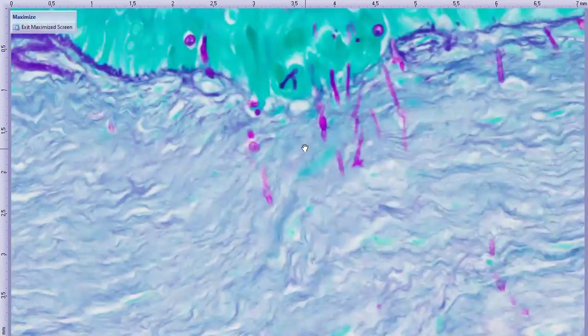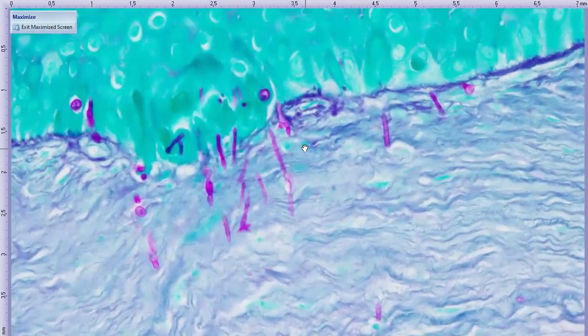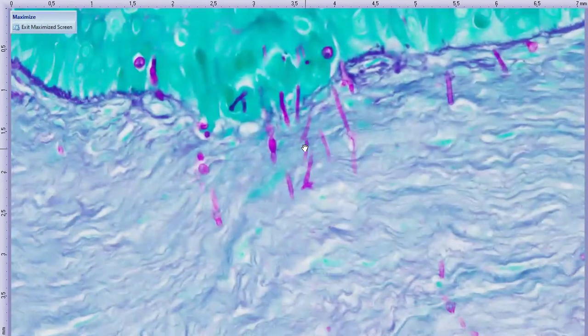So we were joking that if you blew on this dog's cornea, there would be a puff of like mycelial cloud, black mycelial cloud, I guess.